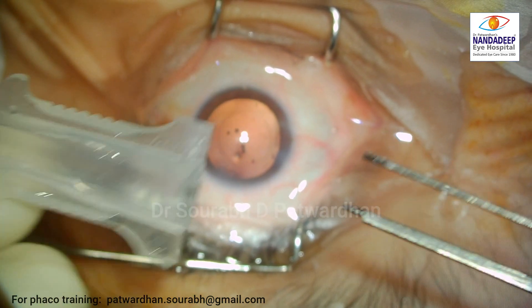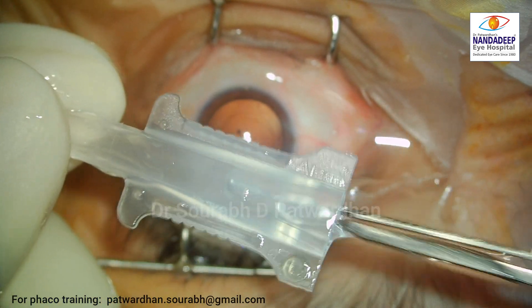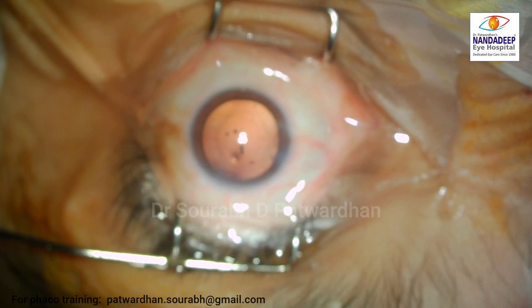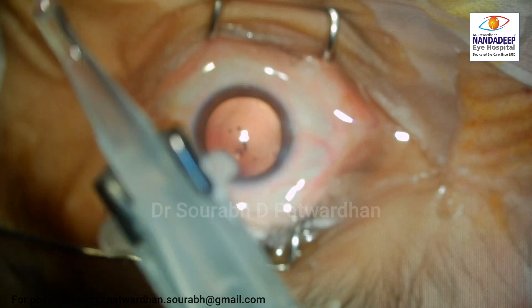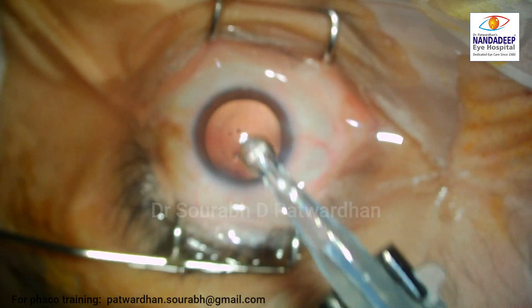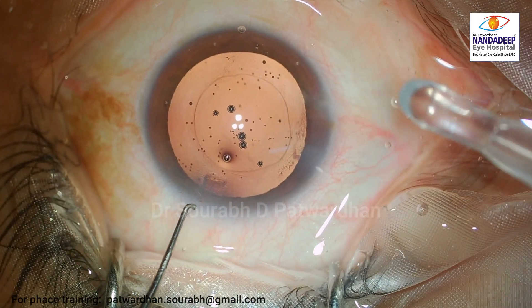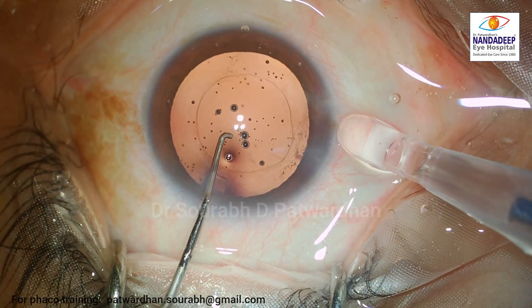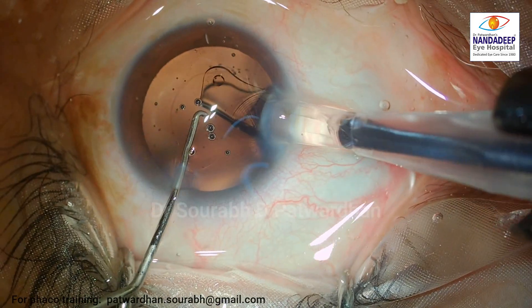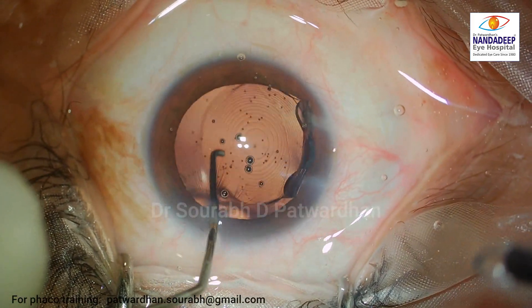The leading haptic hole should be on the left side. Many times when we don't use the same cartridge or the same injector system for the IOL, the IOL may rotate in between. I would have chosen another cartridge which I generally use for hydrophilic IOLs, but even this will do — I have used it a few times before. And here goes the injection. I just have to maintain the leading haptic hole on the left, and I achieve that comfortably.